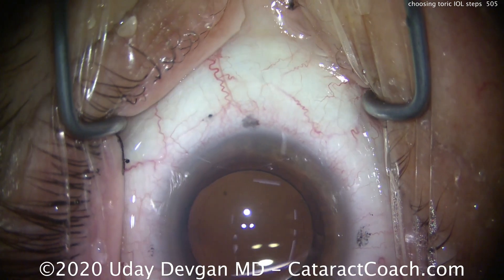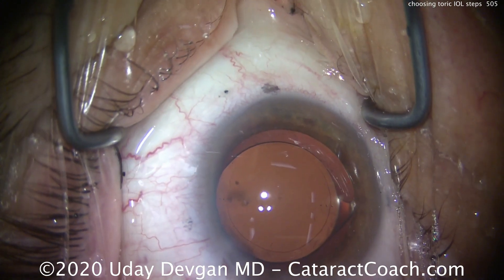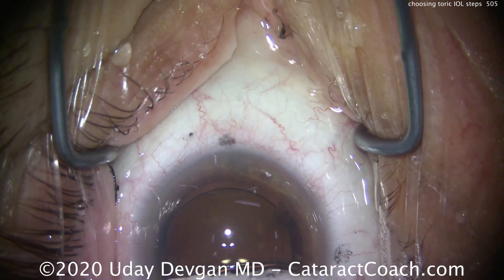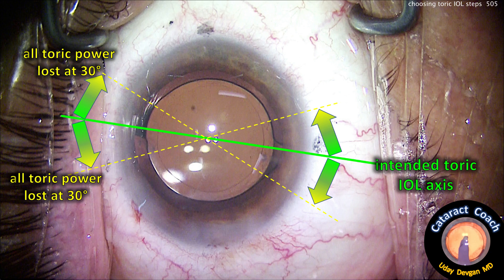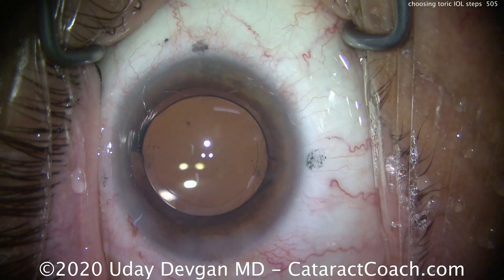Beyond 30 degrees of malrotation, you'll induce an astigmatic change in the wrong meridian. For this reason, some surgeons prefer a slightly higher toric power, so that a small misrotation of a few degrees can be compensated by the higher power. Looking at the example: if you're exactly on the green line at the intended axis, you get full toric power; rotate 30 degrees away and you lose all toric power; 10 degrees off means about one-third of the toric benefit is lost. This is why alignment is so critical.